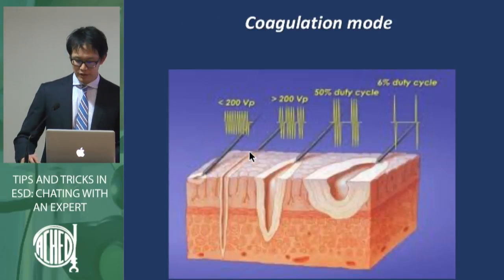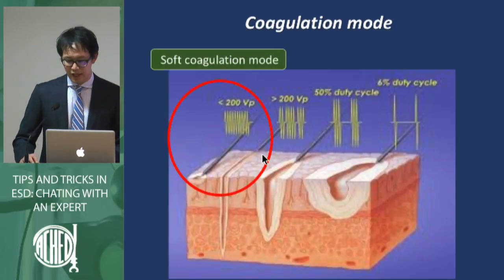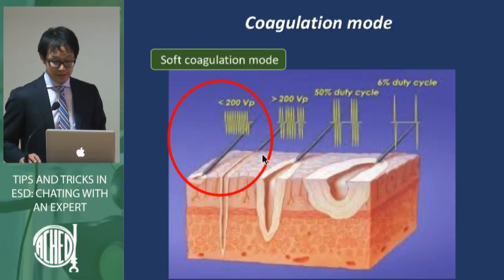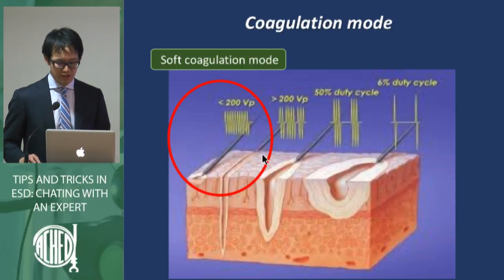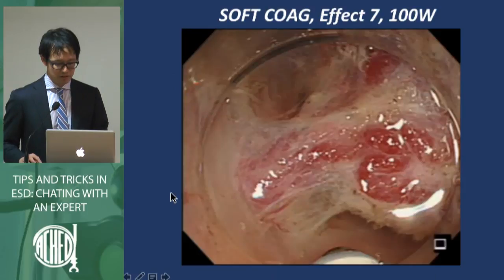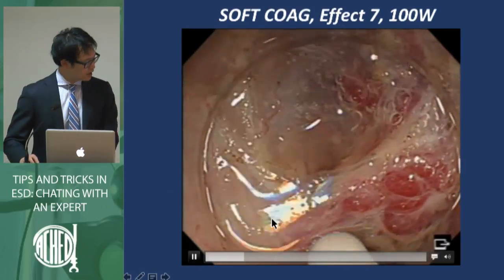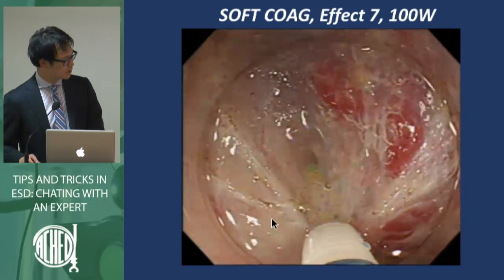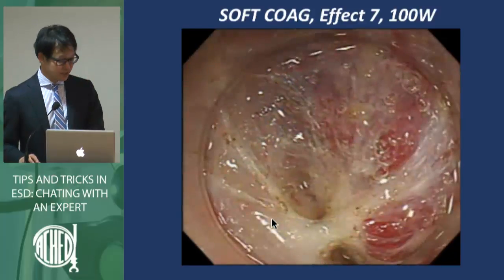And soft coagulation mode is automatically set below the peak voltage of 200 volts. With a peak voltage of less than 200 volts, only dehydration and drying of the tissue occur without spark generation. We usually use soft coagulation to prevent bleeding from penetrating vessels.